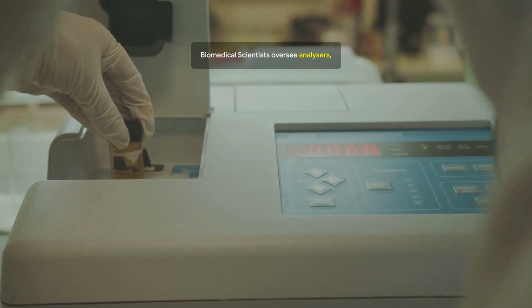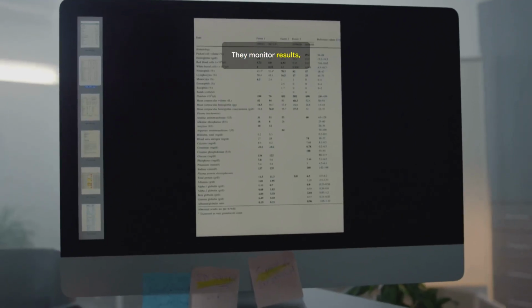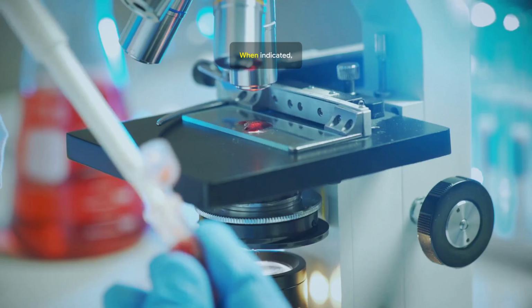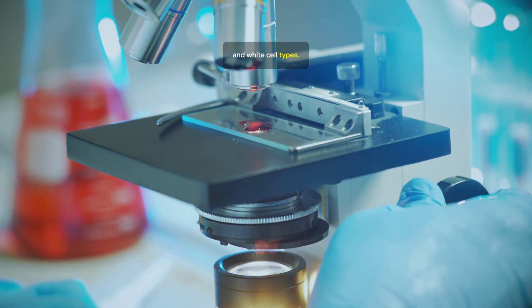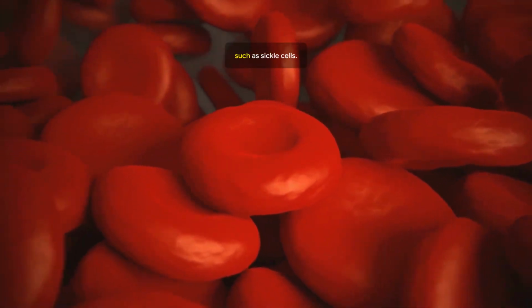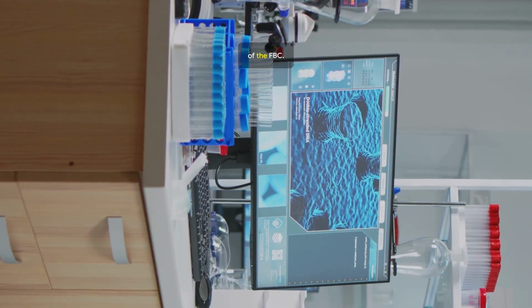Biomedical scientists oversee analyzers, starting with stringent quality control and calibration. They monitor results, watch for critical values, and investigate every flag. When indicated, they create and examine a blood film to confirm morphology, red cells, platelets, and white cell types. They can confirm blasts in acute leukemia or identify features machines cannot, such as sickle cells. For life-threatening findings, a new leukemia or critically low platelets, they telephone results directly to the clinical team. They are the unseen but vital guardians of the FBC.